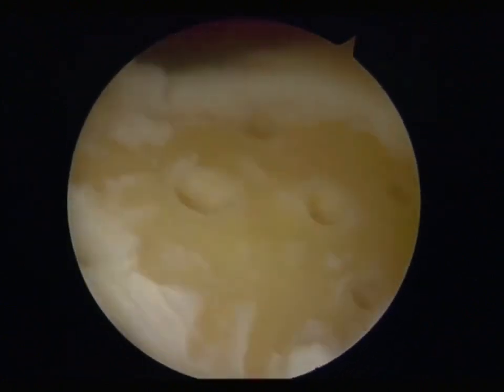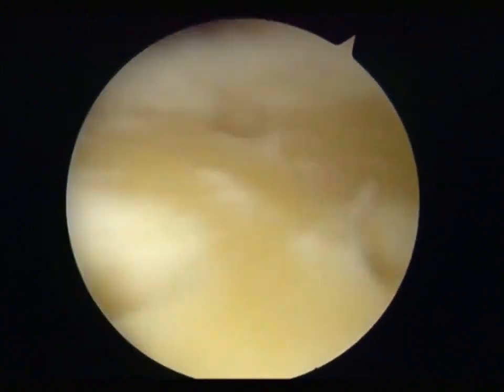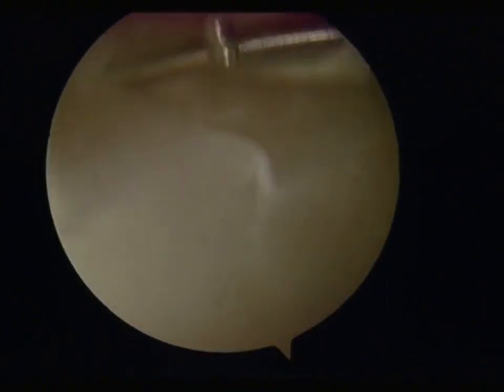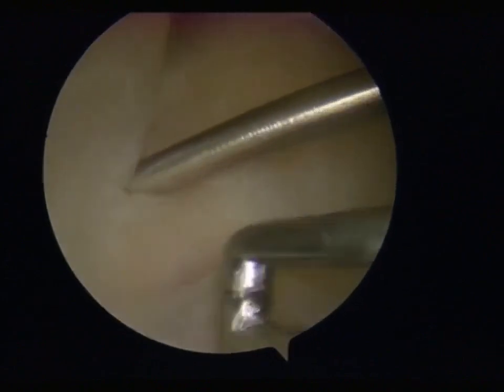After drilling the microfracture holes, clean the debris with a shaver. Then, implant the porcine peritoneum and fix it with Kirschner wires.